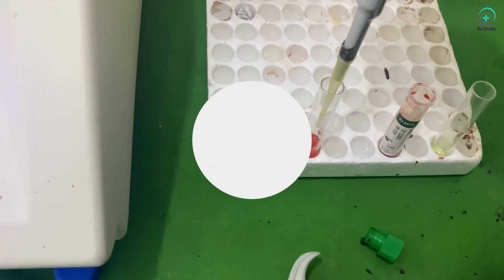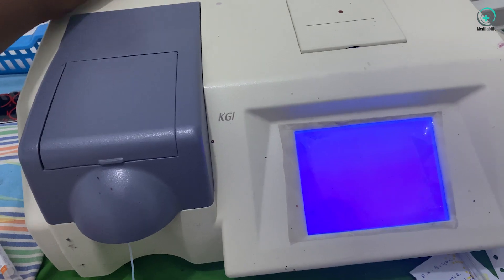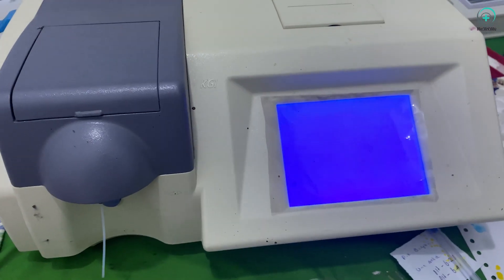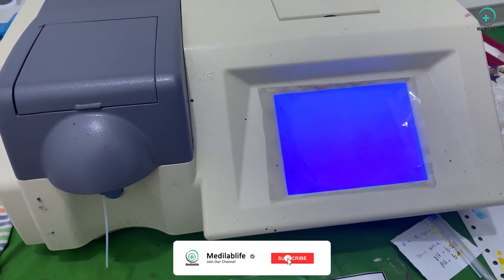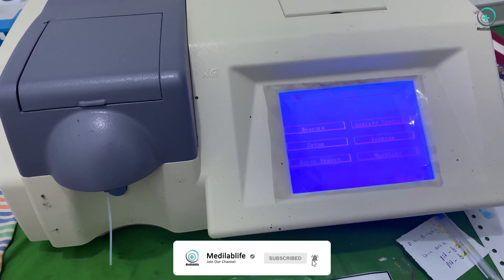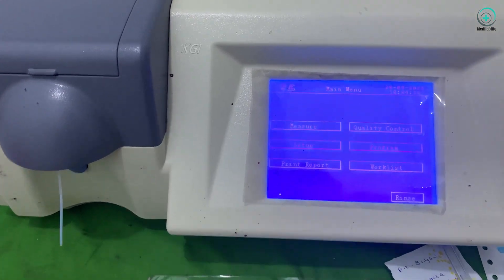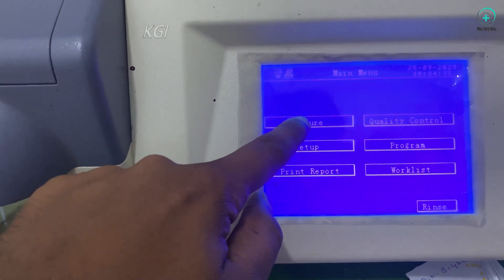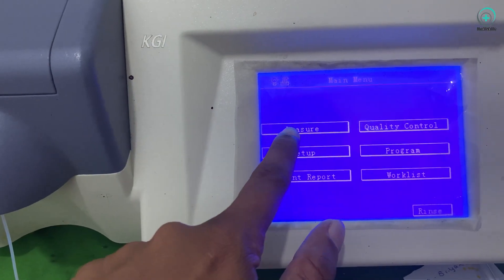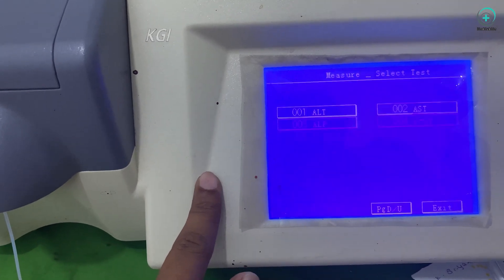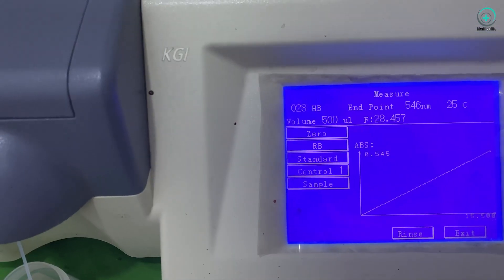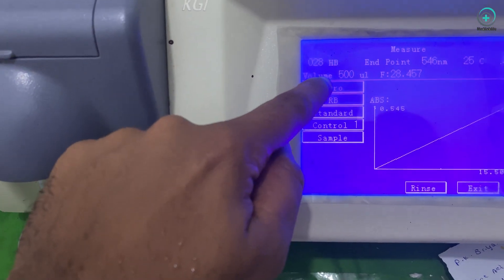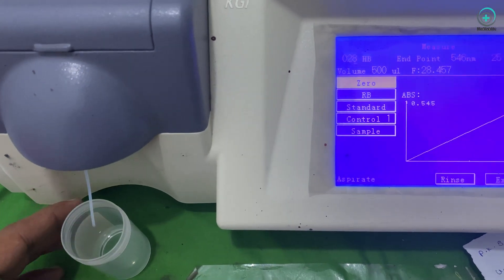Step 4: Setting up the biochemistry analyzer. Select the hemoglobin program on the biochemistry analyzer. Zero the analyzer using distilled water and micropipettes for precision.